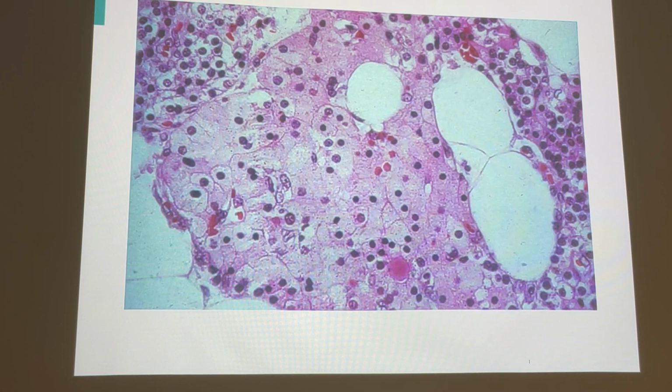One are the chief cells. Those are the ones we care about because they're the ones that make parathyroid hormone. We have no idea what the oxyphils do. I'm sorry? The oxyphils. We don't know what they do. No. Where are they? I don't see it.